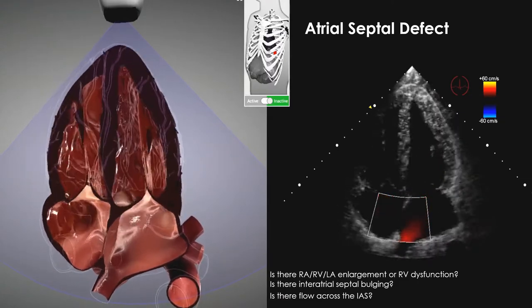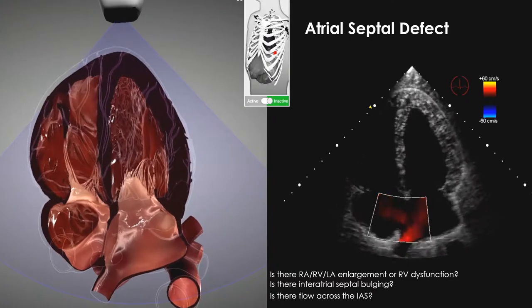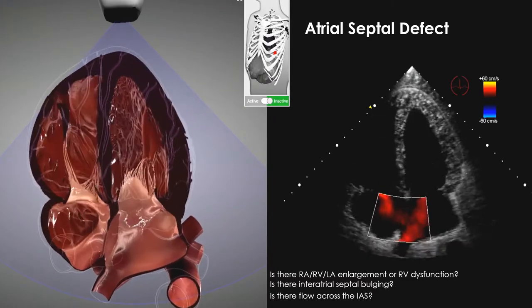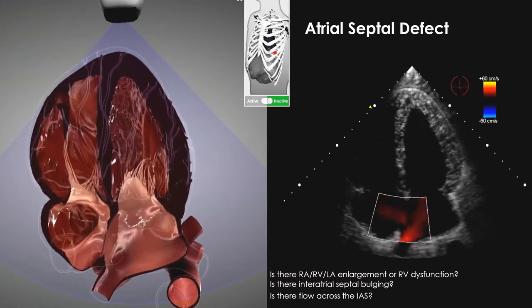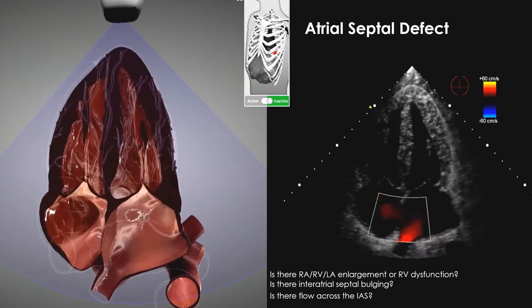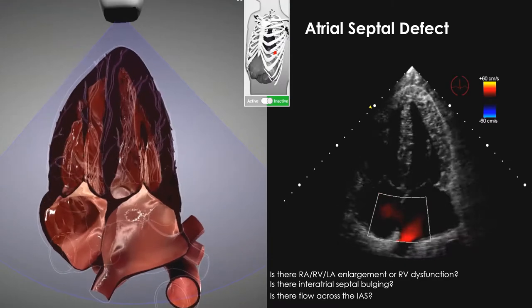Typically you'll see left-to-right flow because left atrial pressures are generally higher than right atrial pressures, unless the patient is coughing, straining, or performing a Valsalva maneuver.